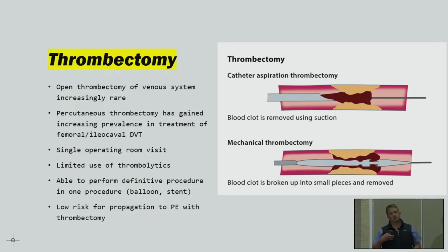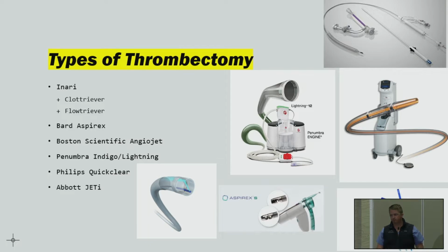As a matter of fact, the Society for Vascular Surgery has guidelines as far as how we treat these patients, and most of them say you don't have to put an IVC filter up before we do these treatments. Now you can, it's not doing any harm, but they haven't demonstrated any significant benefit to that. And you can do the definitive procedure in the span of about an hour and do it almost on an outpatient basis, or often on an outpatient basis, without having to tie up the hospital bed for certain periods of time. So again, there are different types of thrombectomy devices.